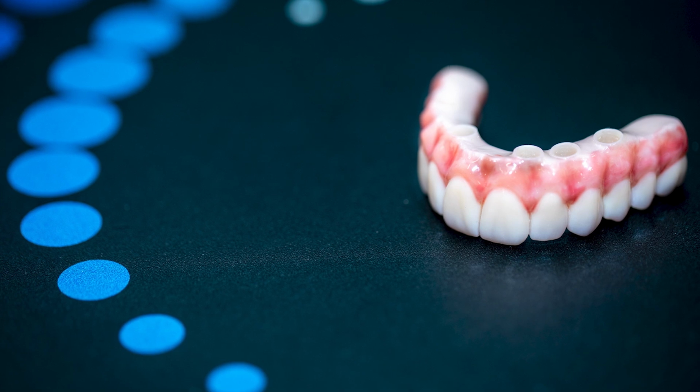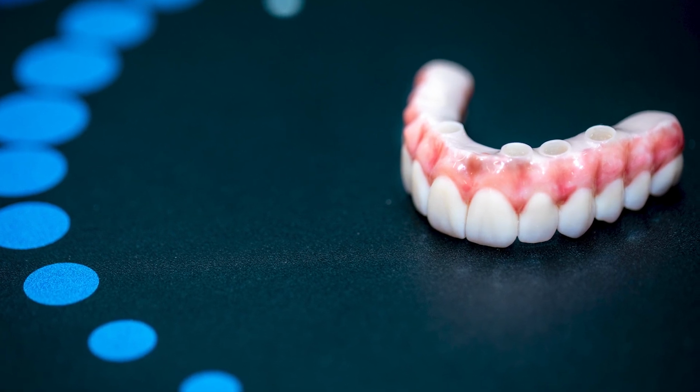From there, the next step is to do the 3D printed try-in after we've got the final prosthesis starting to integrate. That way they can verify their smile. Not only do they get to see it, I get to see it as well. A lot of times I'm going to tell my patient, I'm going to be pickier than you. And it's true because I'm really picky about the work that's leaving this office. I don't want people to think that it's not their real teeth. So I want to verify that so we know where we're going to go at the end result. If I don't like something when I'm seeing it in a digital try-in or in a 3D printed try-in, then we're going to redo that printed try-in, not to make it take longer, but because these are things that you're going to wear for decades. So we take a day or two here to make sure that things are perfect for years and years to come.